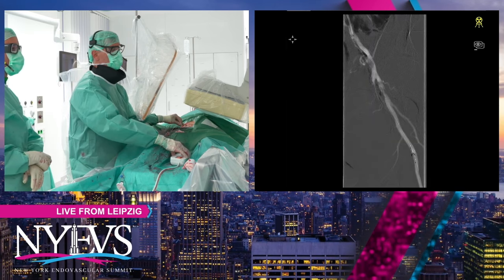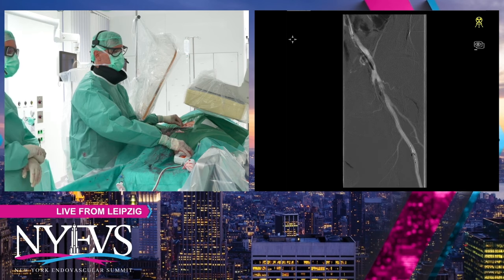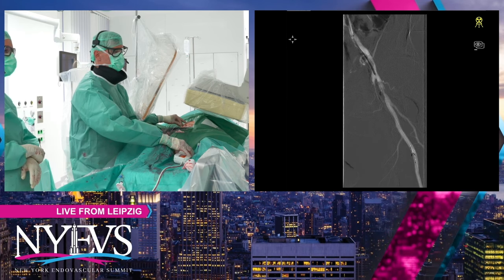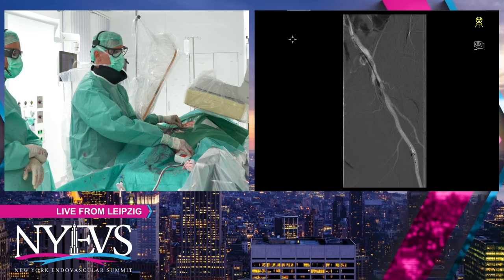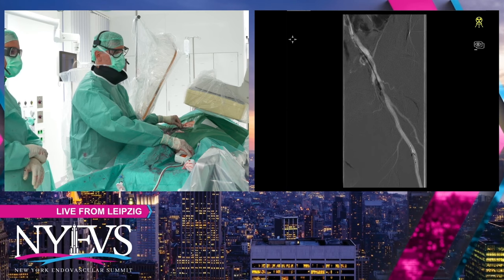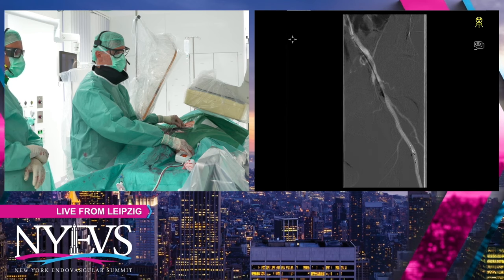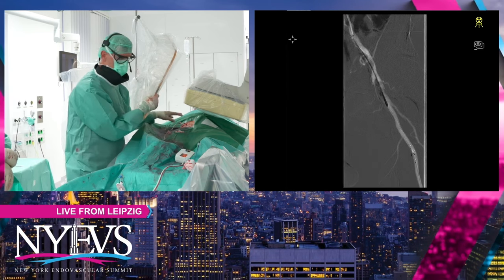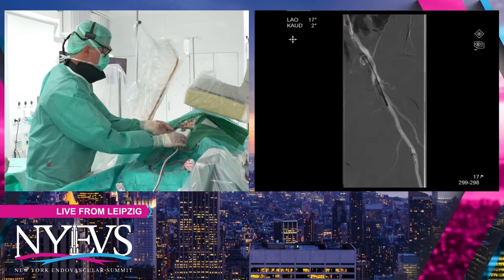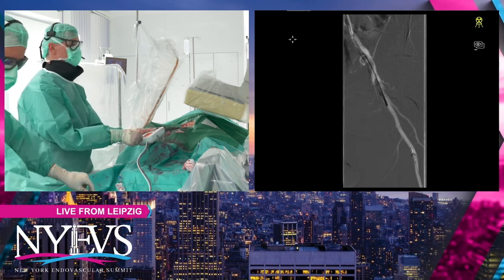Does anybody on the panel have experience with Jetstream? What are your thoughts in this case? What's your technique? Can you help us understand, people that don't use it? What's the technique that you use that's giving you good results? Yeah, more or less it's the same. If there is not a large amount of calcium, you can go directly with blades up, just to save a little bit of time. But currently, I just go in with blades down at the beginning and see how it reacts. In my experience, if there is a lot of circumferential calcium distribution, it does not always work very well. But it depends again also on the thickness of the calcium.